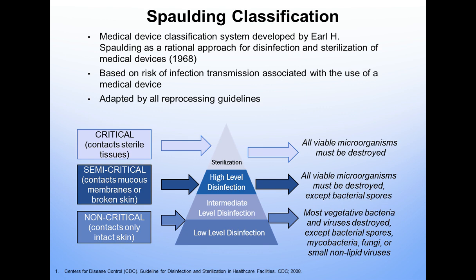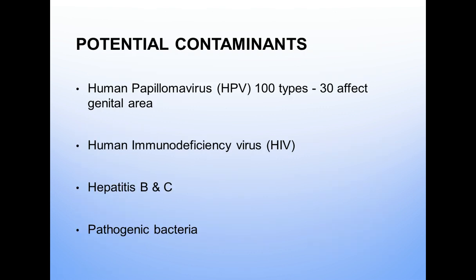And so again, these are some of the most common ones that you would use for abdominal ultrasounds or in the intensive care unit if you're inserting an IV in some of the critical clients.